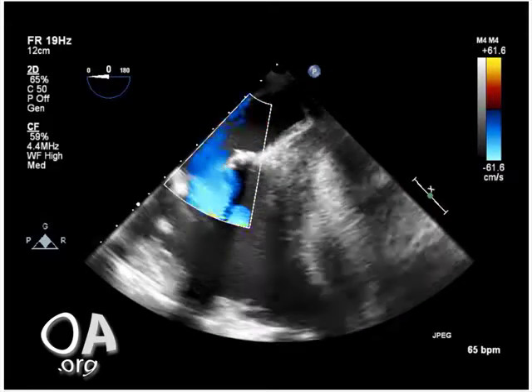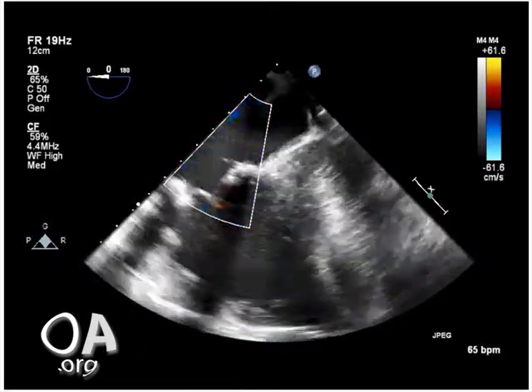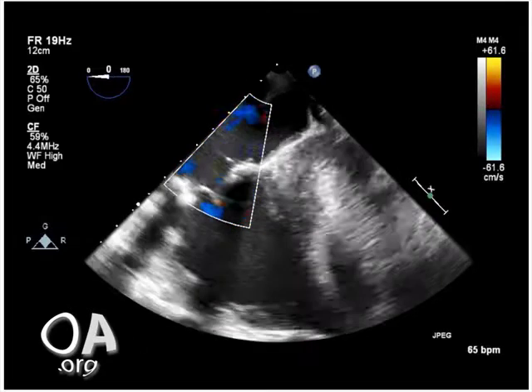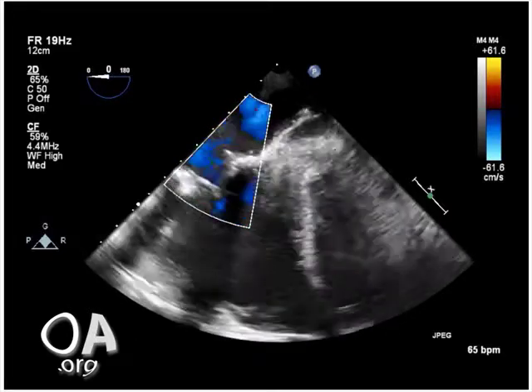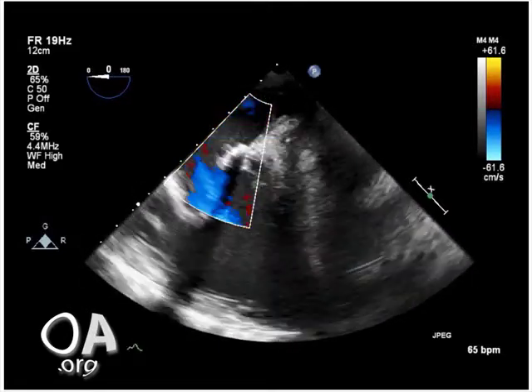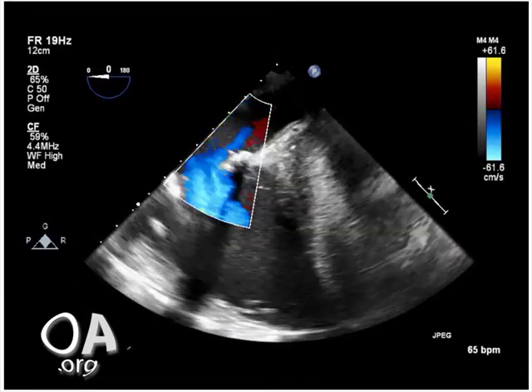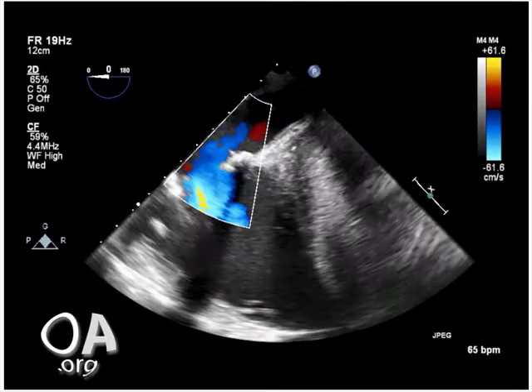This is again the midesophageal four-chamber view, now with color flow Doppler across the new tricuspid valve, and it is important to appreciate that there is no residual tricuspid regurgitation and no leaks outside of the valve sewing ring. In order to do this in a thorough fashion, it is important to image the tricuspid valve leaflets at various multiplane angles, but for this discussion only one view is shown.